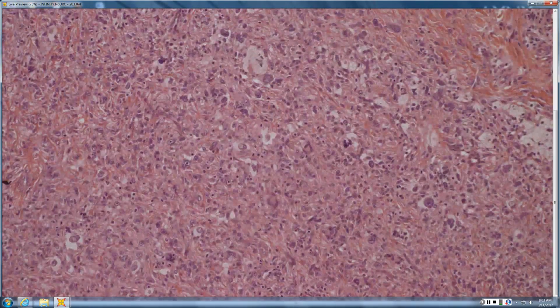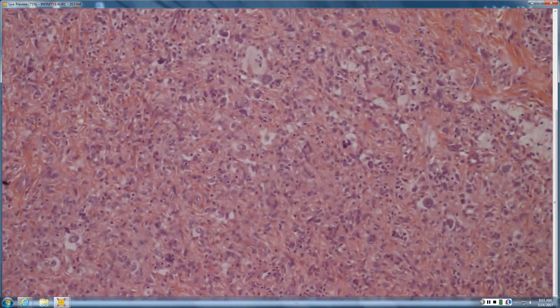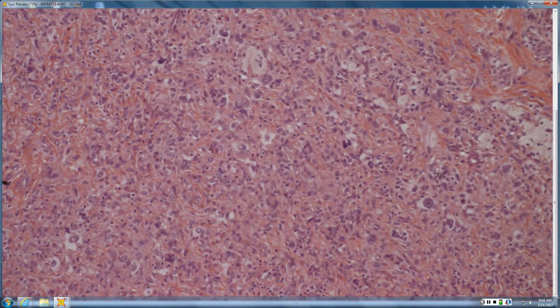So you are, again, playing Jeopardy, and yes, you are correct, dermatofibromas do that. So they do ringed siderophages, but they also do Touton giant cells. So Touton giant cells we associate with xanthogranulomas, but also very commonly with dermatofibromas.